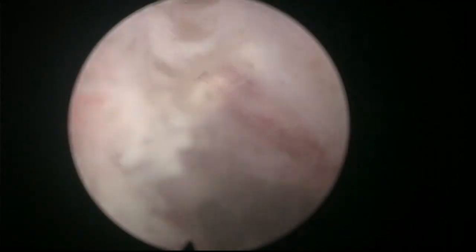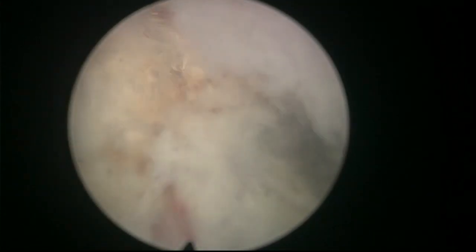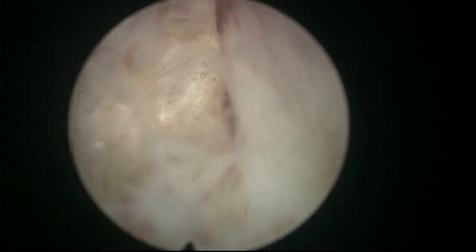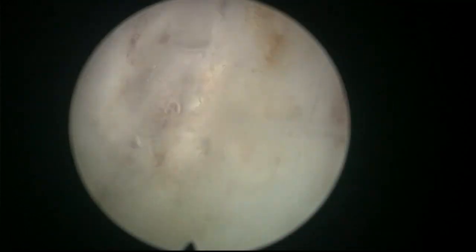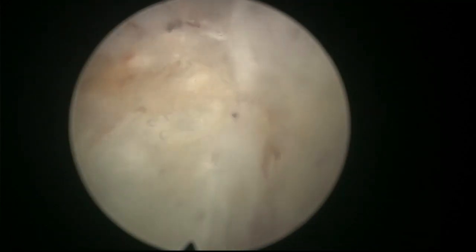Okay, this is the sphincter, this is the white line. You see how important it is to have a white line to tell you the exact location of the sphincter. And many times when you do HoLEP, if you haven't marked the location of the apex, it might be difficult to recognize where it is and you might get into trouble. So I think this whole technique is designed to make it safe for the sphincter.